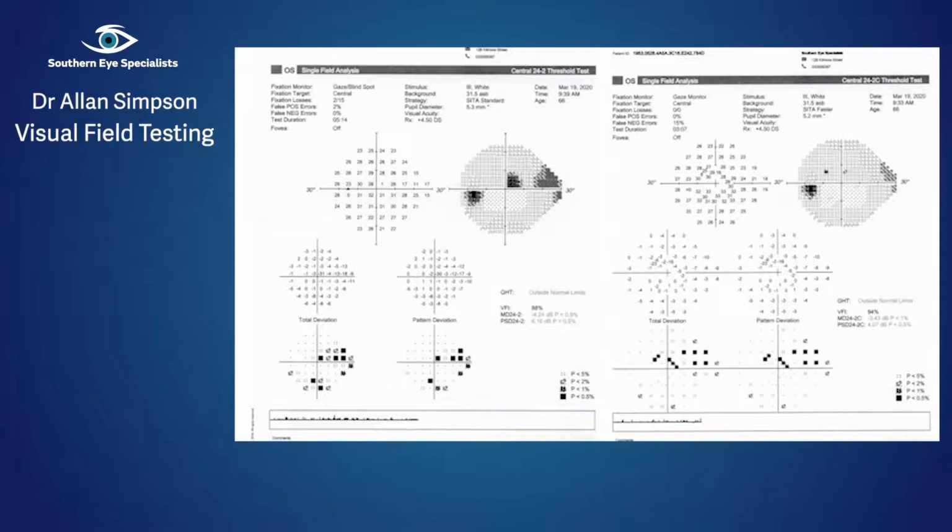Well, yeah. Most things can be caused by glaucoma. You can get all sorts of varieties. You saw in that previous AI plot of all the different parameters you might get, all different kinds of field loss you might get in the central 10 degrees. And this is no exception. You certainly do quite often see a defect just like that. And you often see this almost square box right there simply because we're testing one point there, I think, and you just get a square box and it looks rather odd. It doesn't really mean a great deal, just lack of testing spots really.